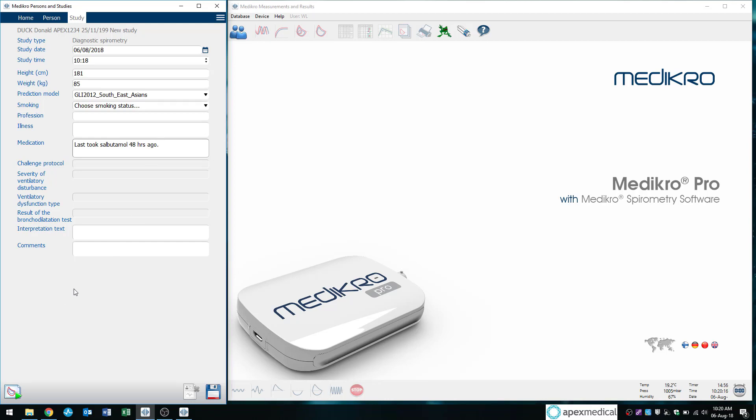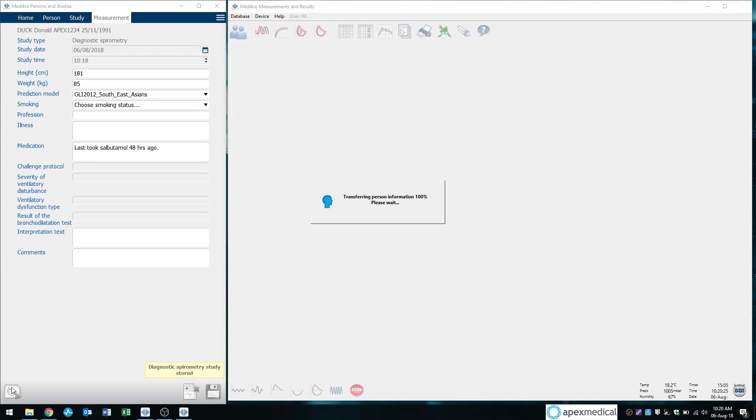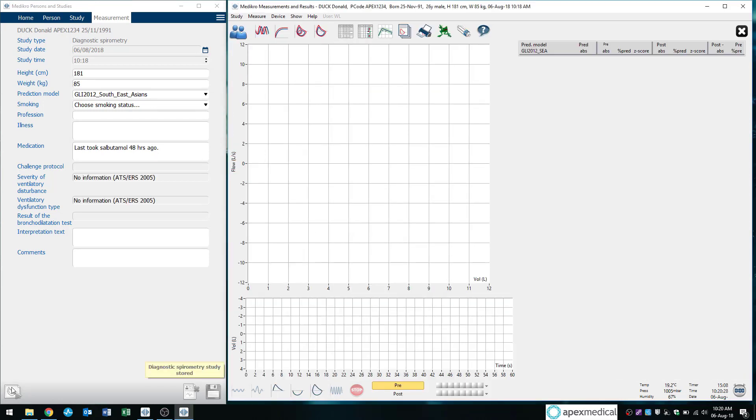So once again, always press the button at the bottom left. Proceed to measurements and results. I'll click that once. Give it a second. And it's going to pull all of those demographics that we just entered over onto the right screen. And we're ready to start testing.